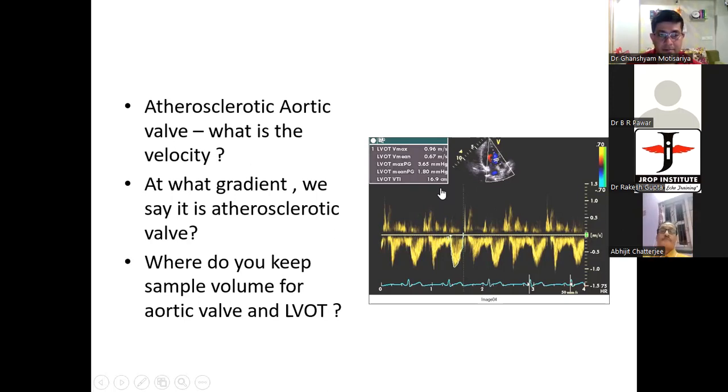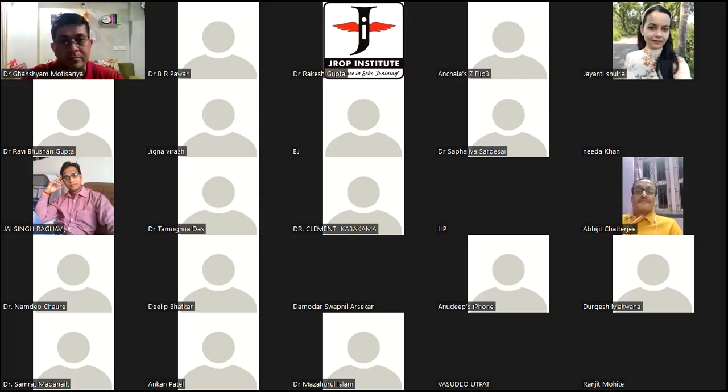All right. So I think we have done reasonably good. It's 9:45. And anybody would like to ask any question before we close down this session today? Now it's a reverse thing. If somebody wants to clear his or her doubts, they can ask. Me and Abhijit are there to answer your questions.